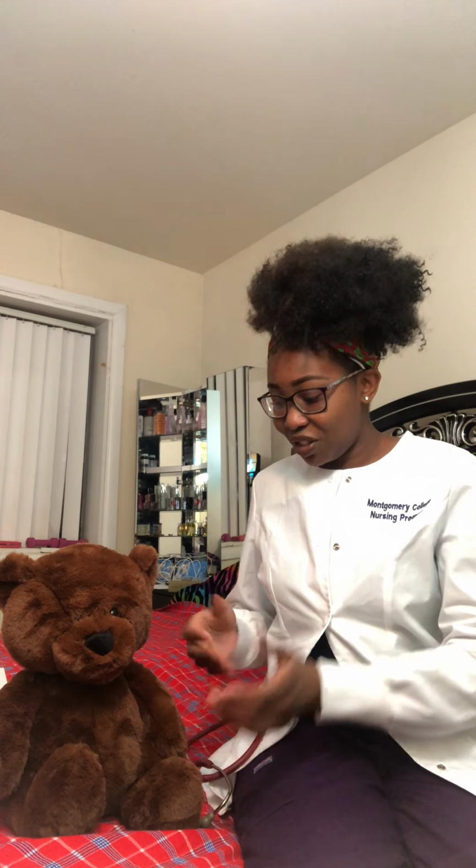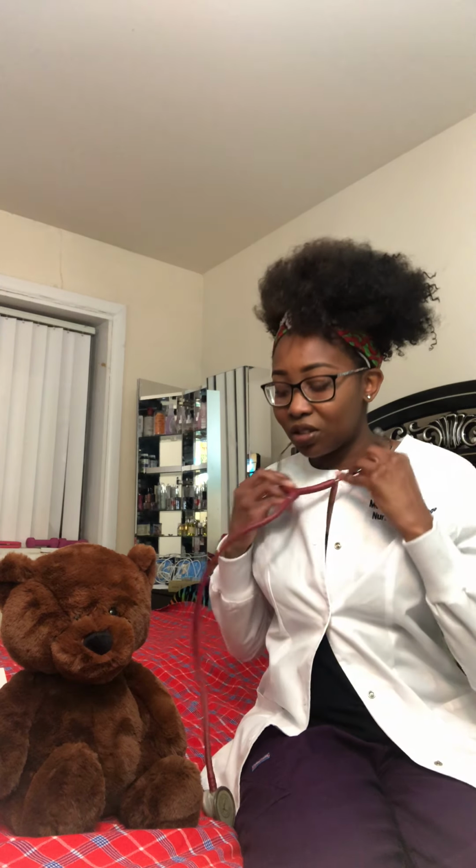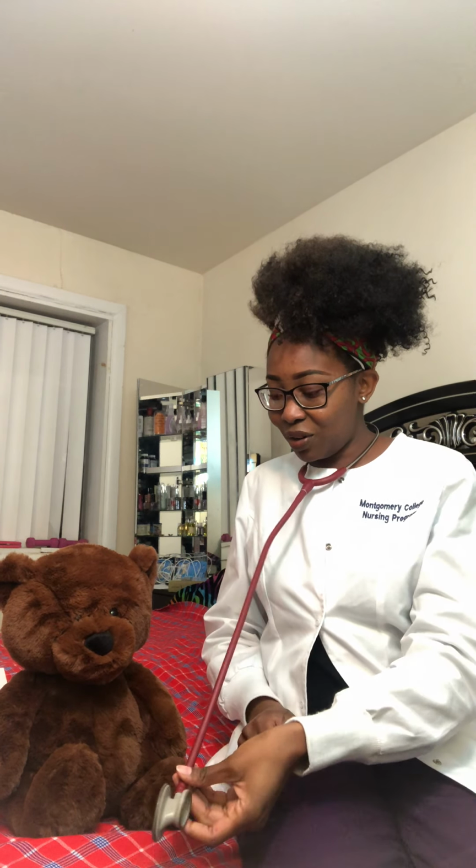All right, so after the heart, then we would go ahead and auscultate the lungs. So anteriorly, we would auscultate the lungs. I would put on my stethoscope and start with the apex.